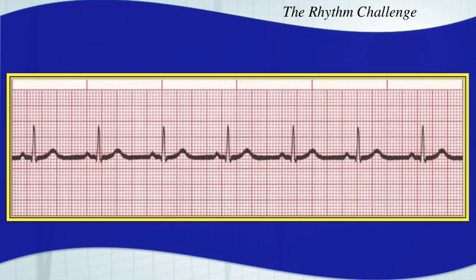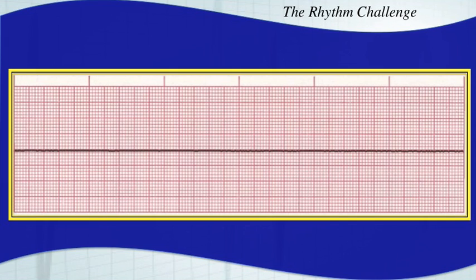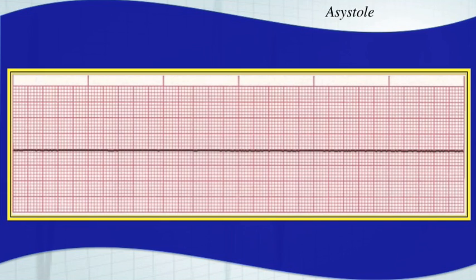This is just a sinus rhythm with 60-cycle artifact. Look at that thick baseline. And this next one is easy: asystole. Start CPR. Asystole — or your EKG monitor isn't on.